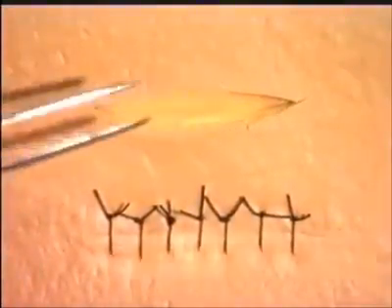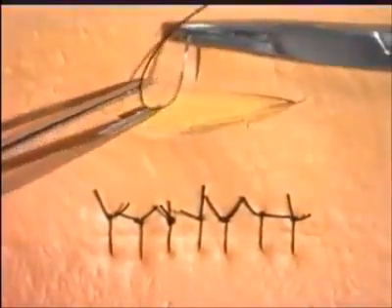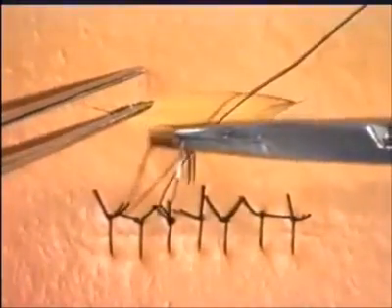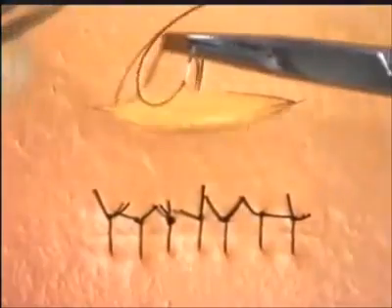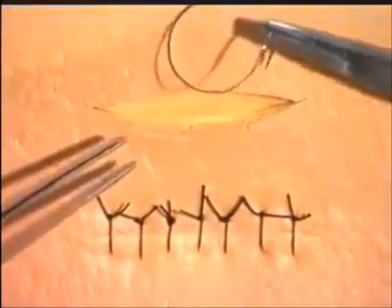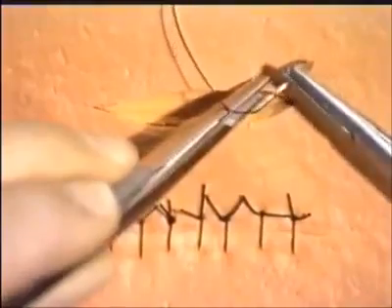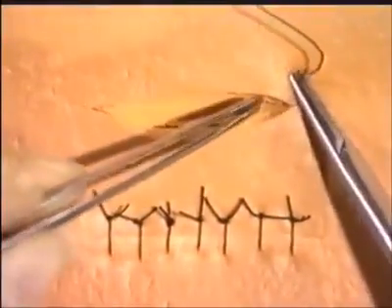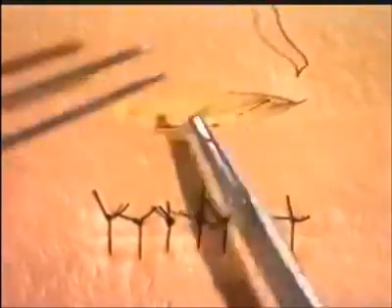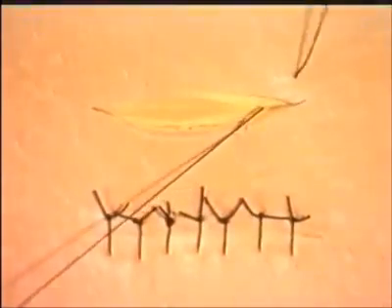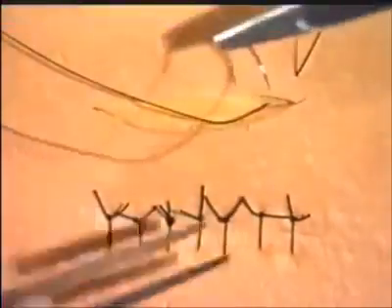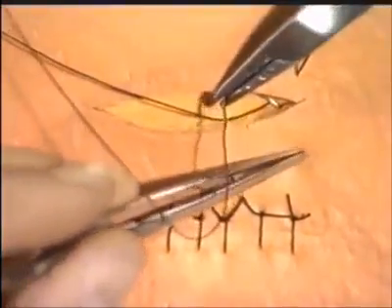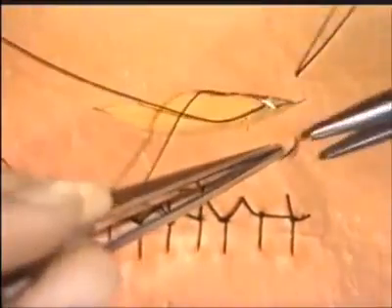In this situation, it is not practical to start in the middle of the wound, as such a suture will be under too much tension, and therefore inaccurate. Thus, in this situation, start at the end of the incision, inserting a suture at right angles, and getting right down into the depths of the incision, and then come back at the other edge of the skin, again at right angles to the skin edge, and ligate that particular suture.